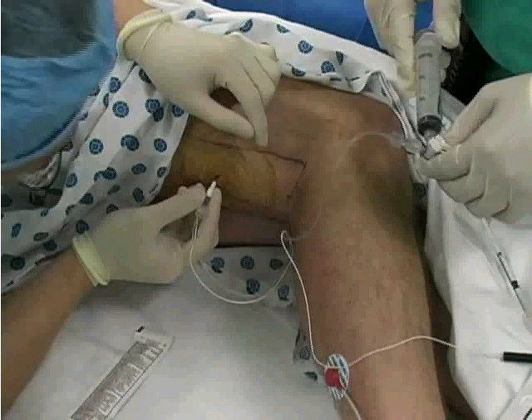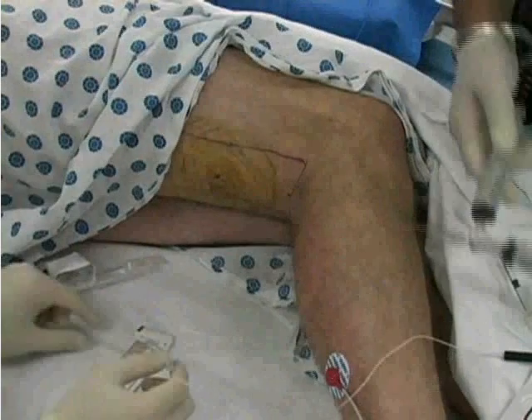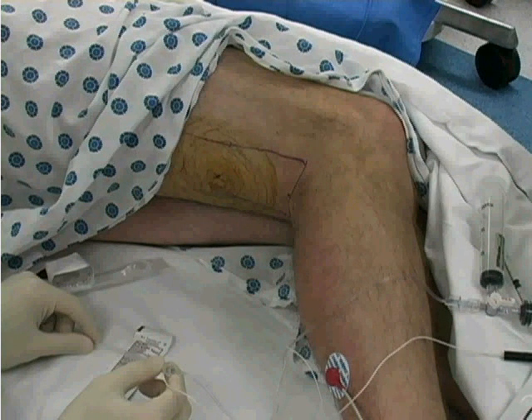After the anesthetic has been injected, remove the stimulating needle. Depending on the anesthetic used, the patient may not experience the complete effect of the block for up to 25 minutes.